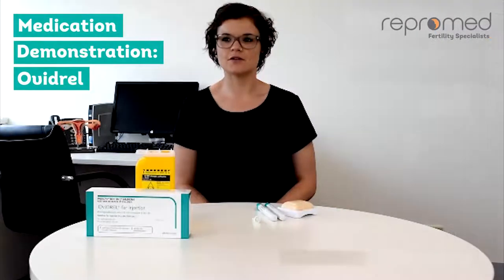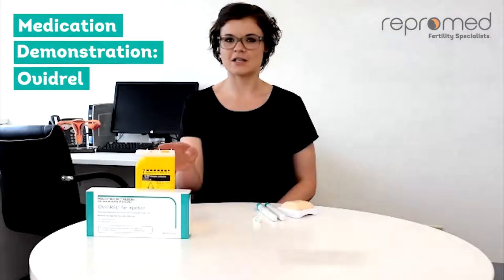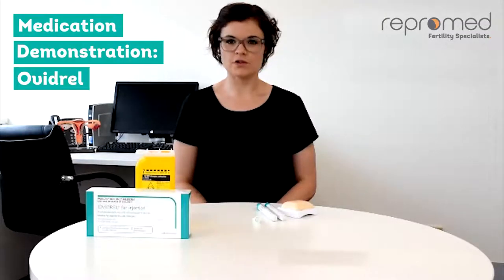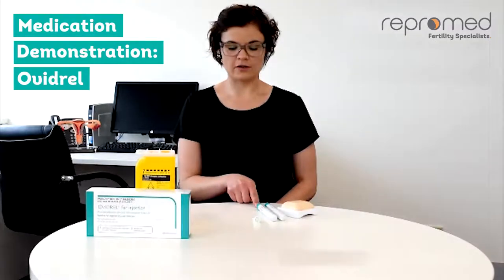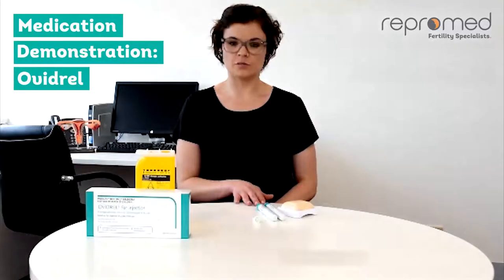To administer your Ovidril dose, you will need your Ovidril pen, disposable needle, and sharps container. Ovidril is dispensed in 250 unit pre-filled pens. Your dose is the dose prescribed to you by your specialist. You will be prescribed either 250 units, which is one pen, or 500 units, which is two pens.